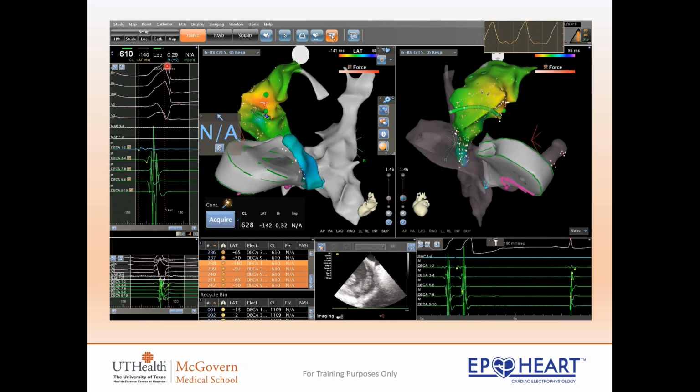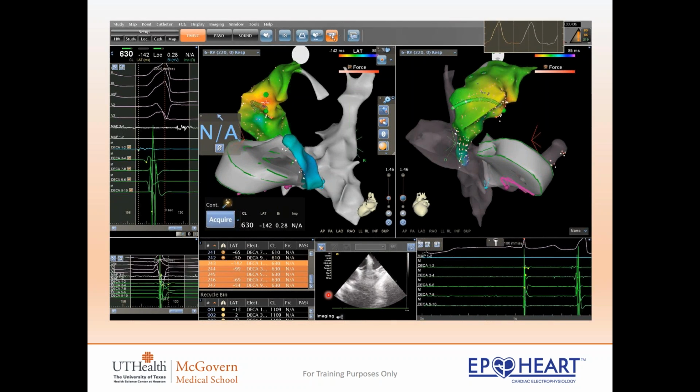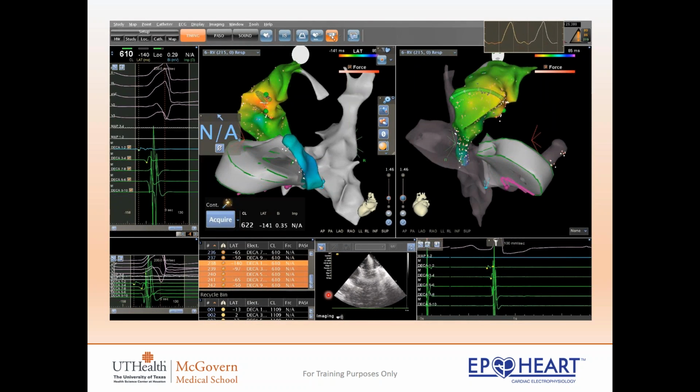It's dead. So this is ultrasound. We use ultrasound in the EP lab. You can see the aortic valve going right here, and this is the pulmonic valve over here. So this is the RVOT area, or the right ventricular outflow tract in the right ventricle. A very common location for someone to have PVCs who doesn't have any structural heart issues.